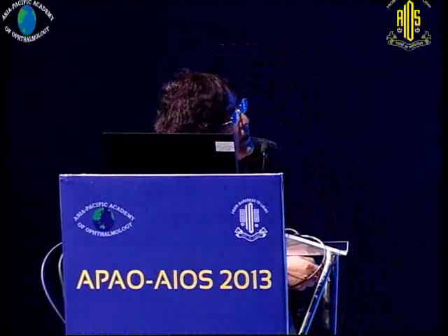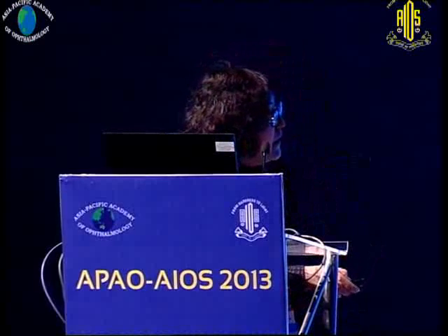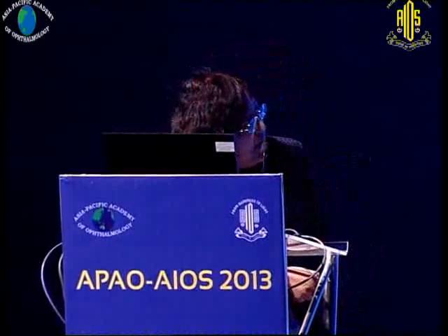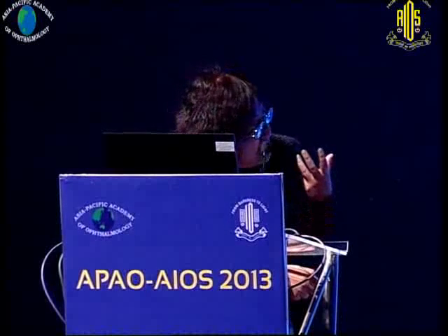This is also an OCT from Dr. Yutaka. See, here is the traction, and this traction can dip into the optic pit. So I think vitreous traction plays a crucial role. And this is for understanding the cord. This dot means the retina, and the cord means the traction. If we cut off the cord, then the retina goes back to its position.